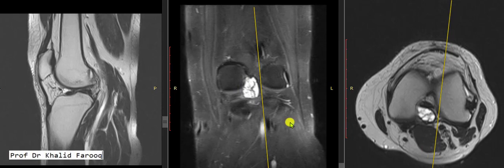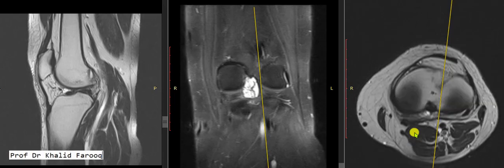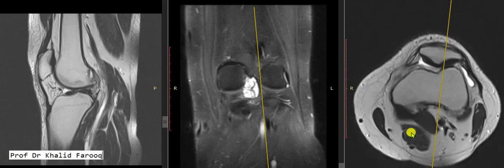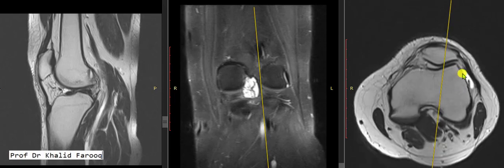Here we can confirm this multi-septated ganglion cyst behind the posterior aspect of the posterior cruciate ligament. This is the intercondylar notch, this is the posterior cruciate ligament, and here we can see an oval-shaped, multi-septated cyst behind the posterior aspect of the posterior cruciate ligament. This is a ganglion cyst behind the posterior aspect of the cruciate ligament.